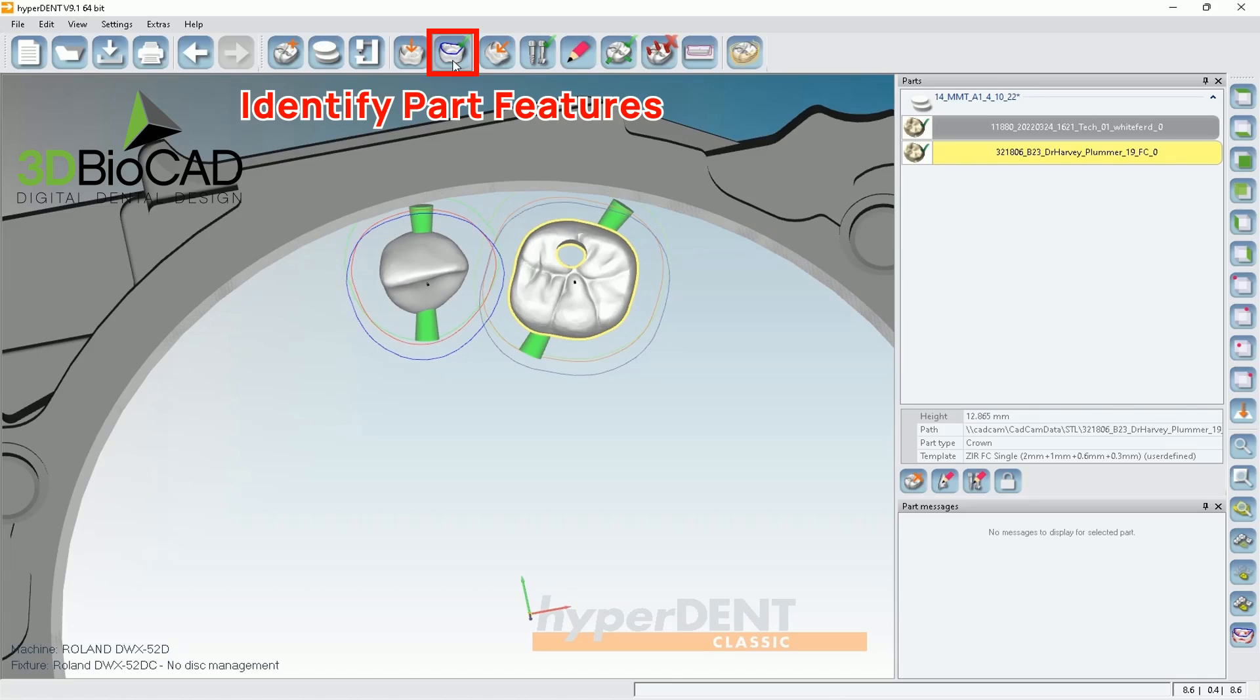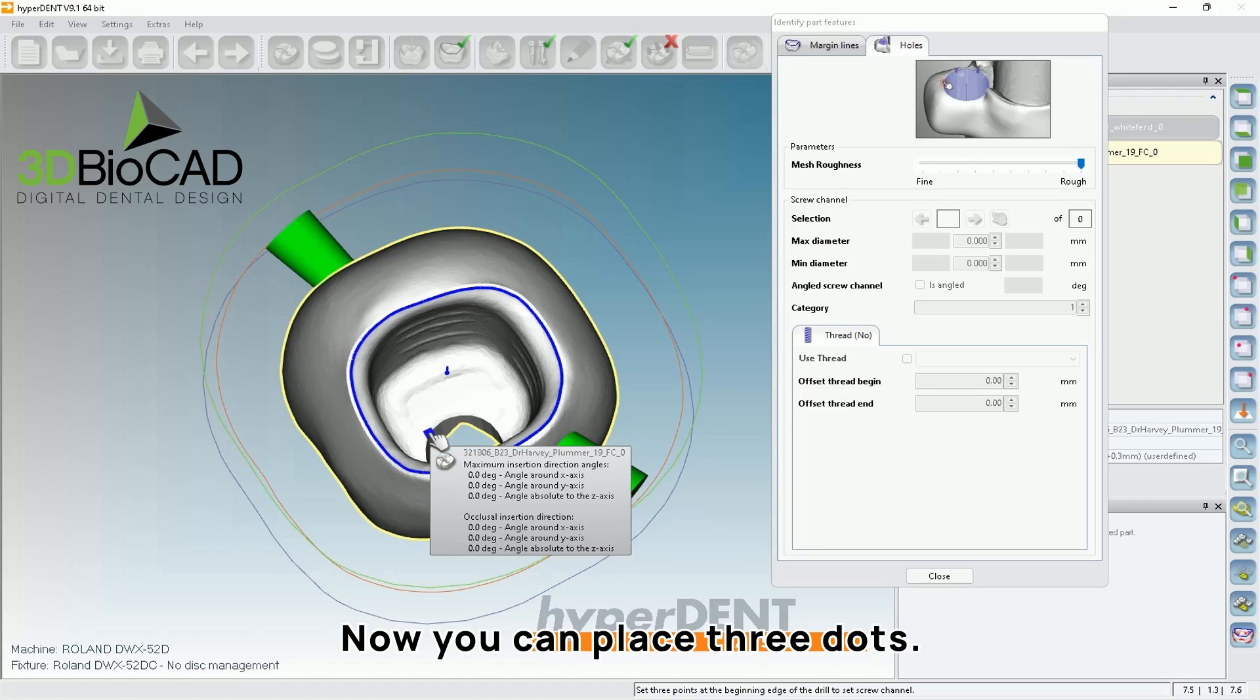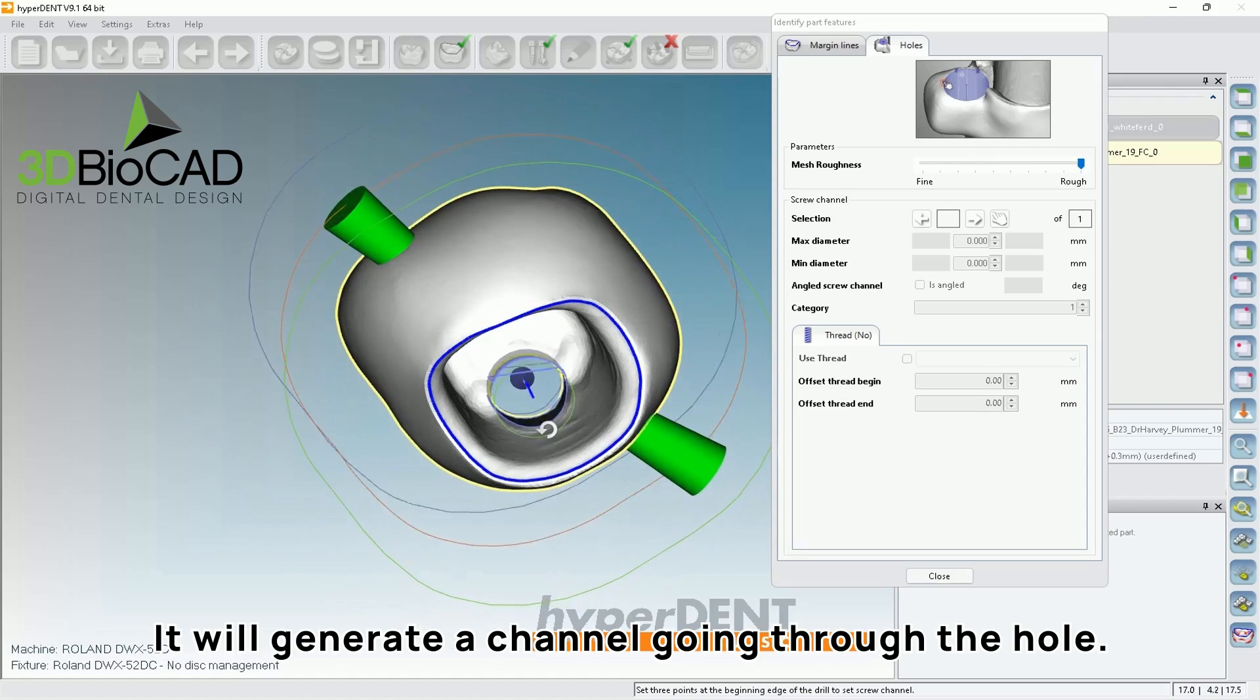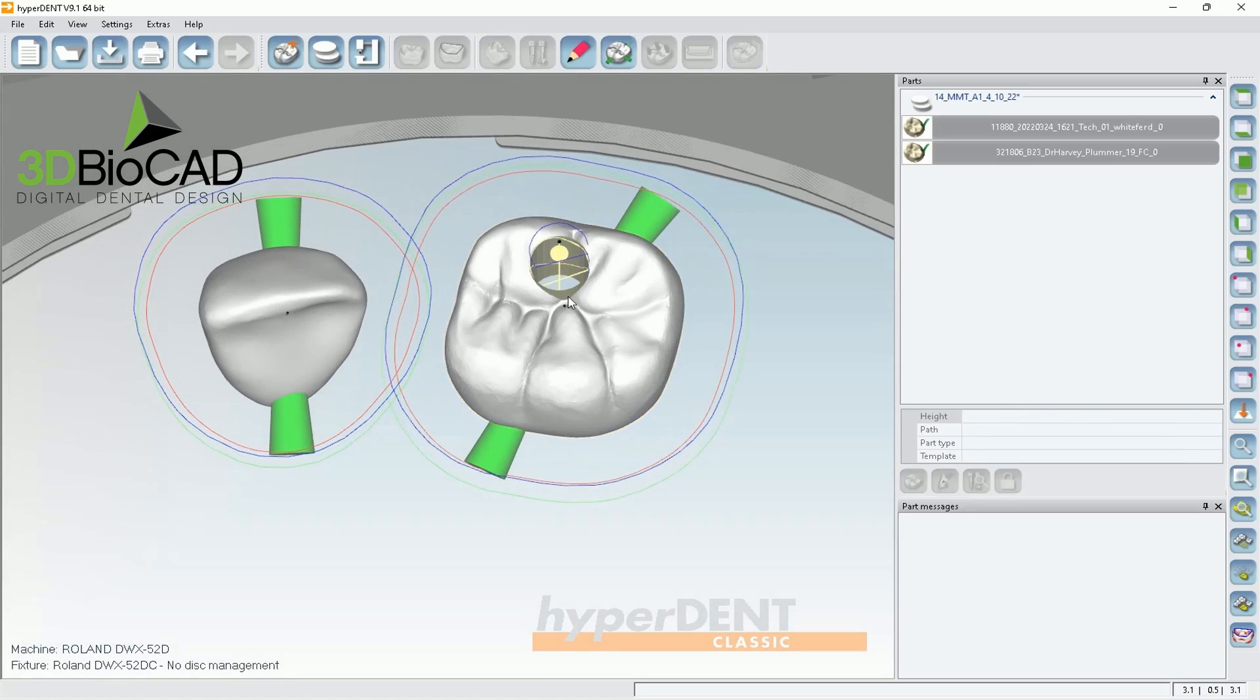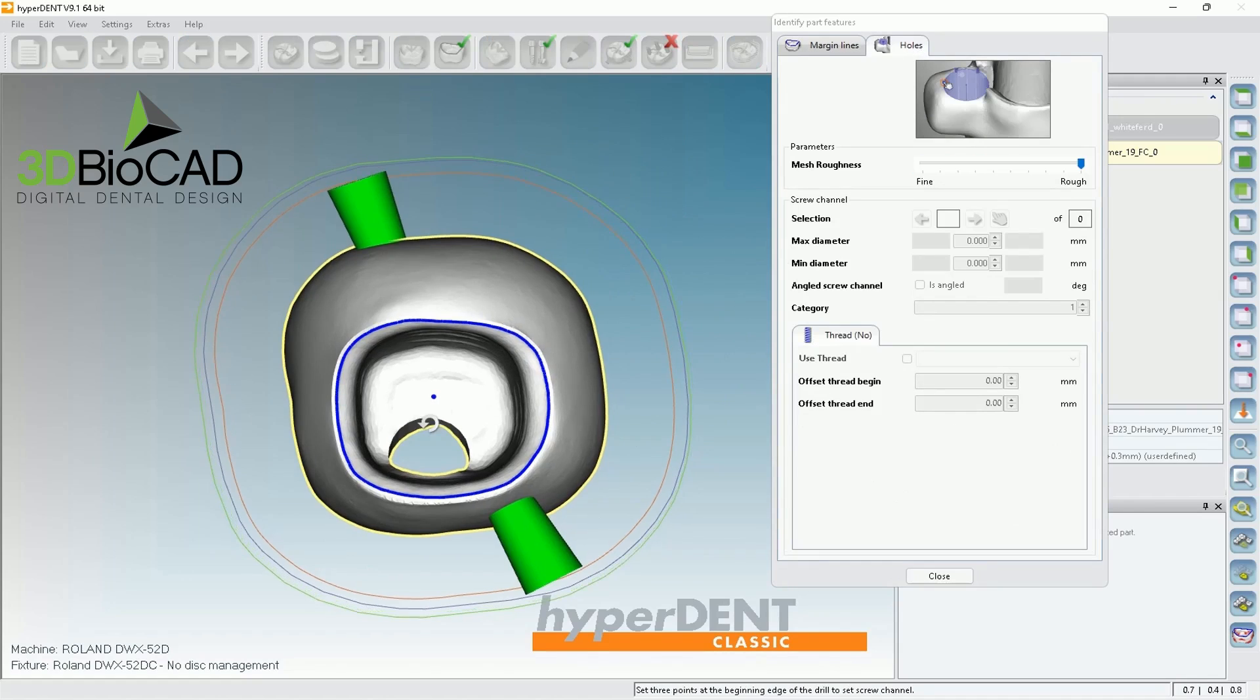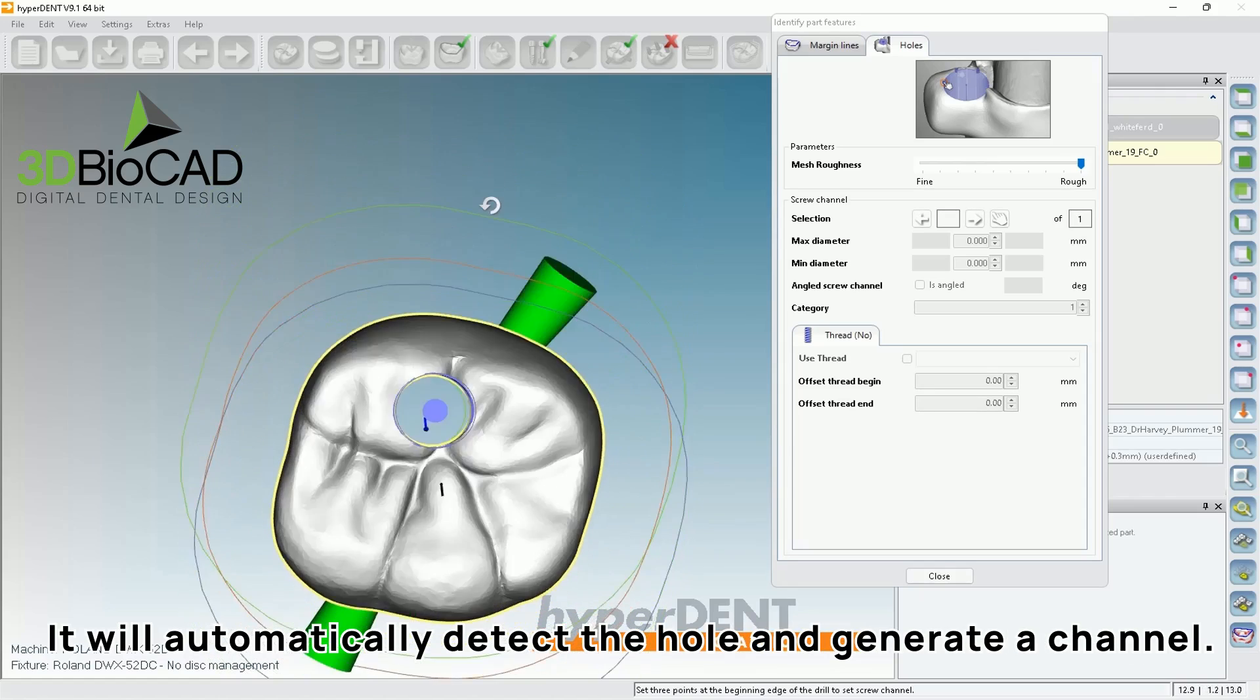And you notice there's a hole that we have to identify. So by clicking identify part features, go to holes. Then you're able to select three dots. So first dot, second dot, and third dot. So it'll generate this channel. But a lot of times if the channel looks a little weird. So when I look at this, it's not fully circle. So I'm just going to delete it and try to mark it again. Sometimes it's funny. You don't have to click on the cylinder directly. You can actually choose from outside. Then it actually selects the better channel.